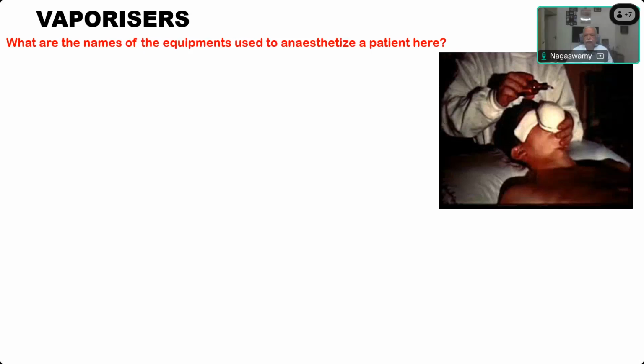Okay, very good. 4 to 6 layers of cloths, tissues. Schimmelbusch mask comes with a cloth layer, okay, or a gauze. What is the purpose of that cloth or gauze? So for a prolonged delivery, to maintain the constant. What is the correct terminology you should use for this?